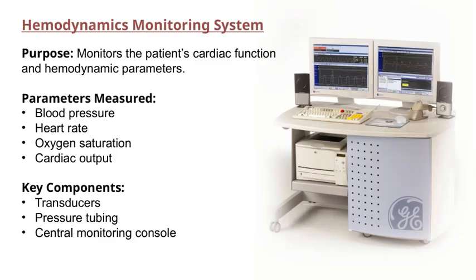Now, let's take a closer look at the hemodynamics monitoring system. Its primary purpose is to keep an eye on the patient's cardiac function and various hemodynamic parameters that are crucial for assessing their overall cardiovascular status.